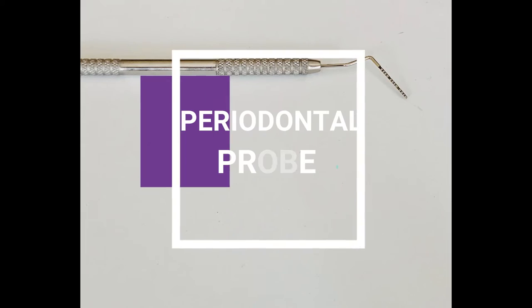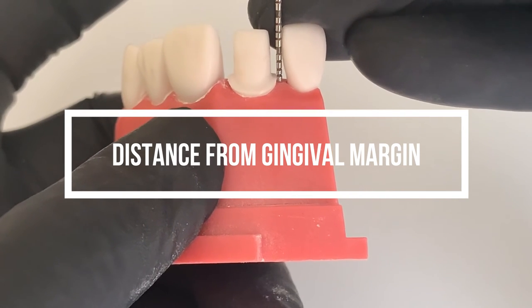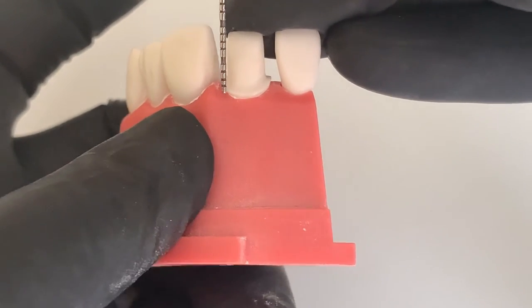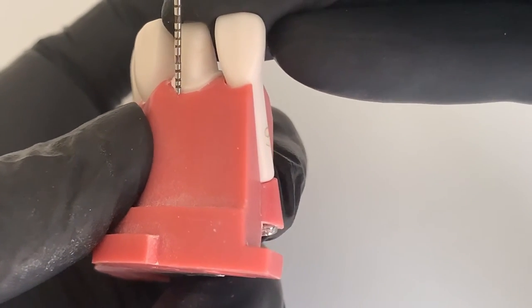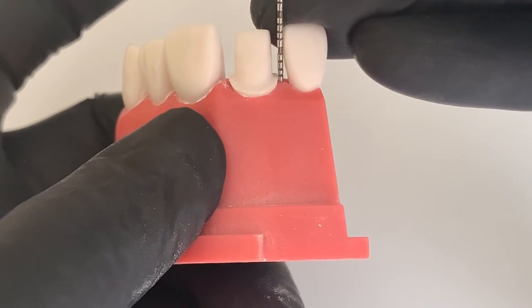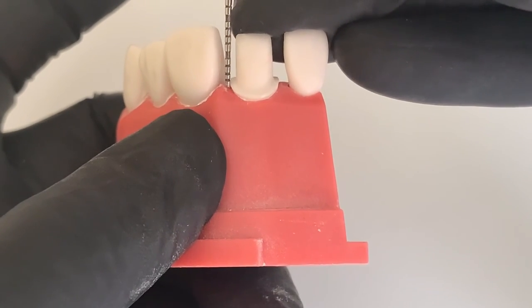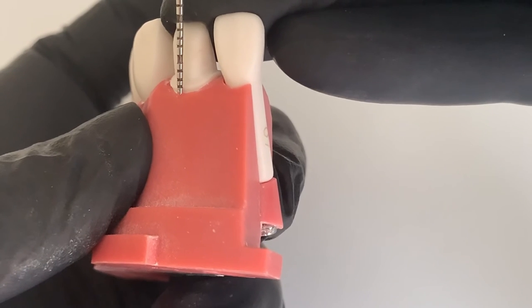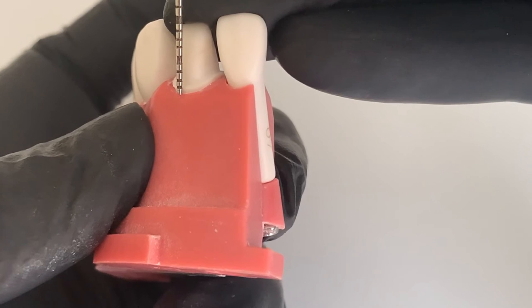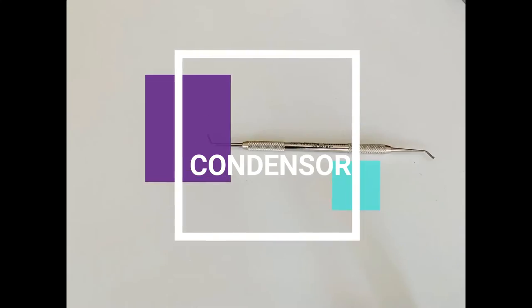The next very important tool is a periodontal probe. It helps you measure the distance between the margin and the simulated gingival margin. Most schools will want you to have a 0.5 mm supra-gingival margin. When you run the periodontal probe from one side to the other, you can determine in which areas you are short or over. Here I was trying to maintain a 1 mm supra-gingival margin and the periodontal probe was helping me check if my margin is uniformly 1 mm supra-gingival.